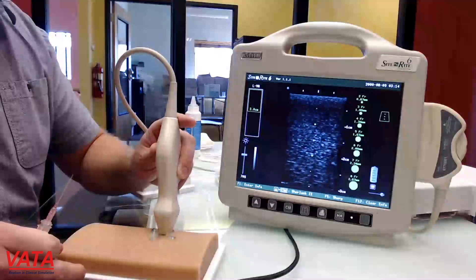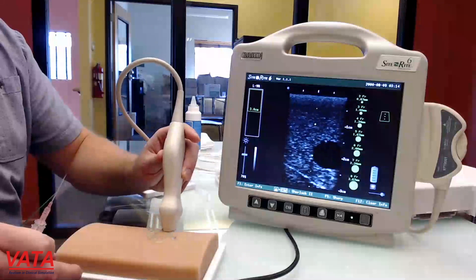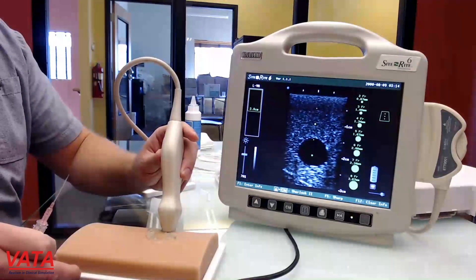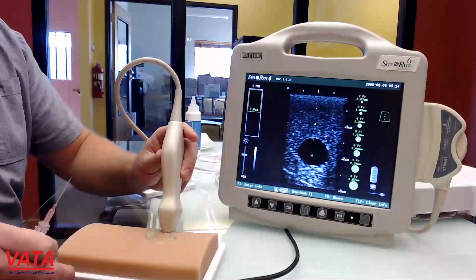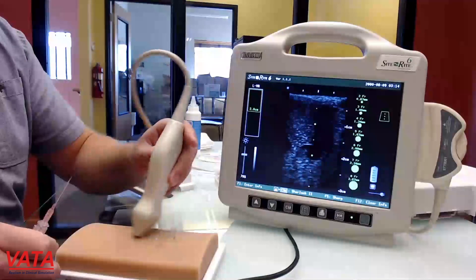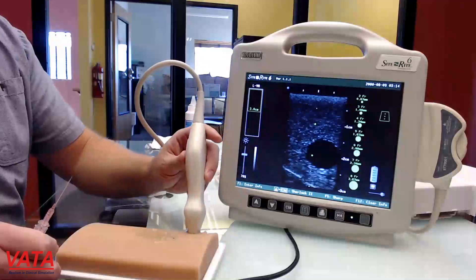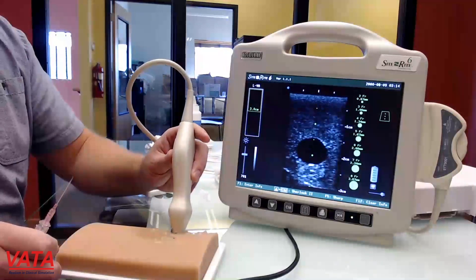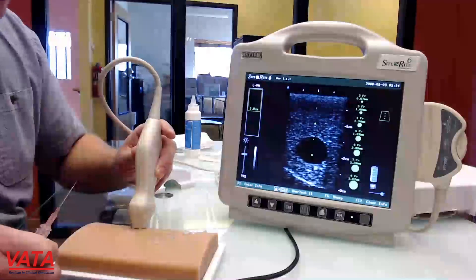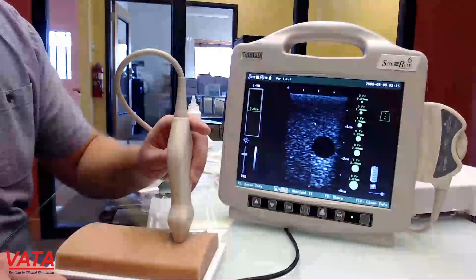Let me go through and show you each one of the veins. This one over here is our larger, deeper vein. You can see this vein is about a centimeter in diameter and it's about a centimeter and a half down. As we move up and down the vein, you're going to see that vein there.